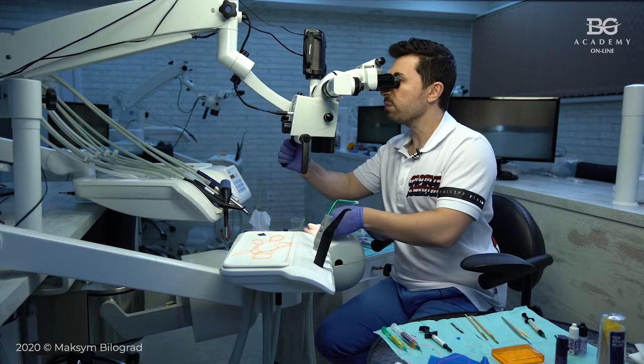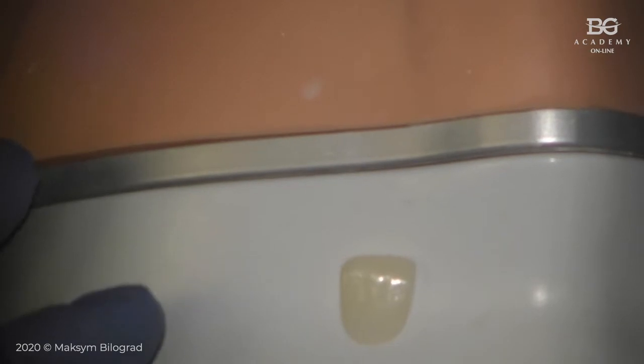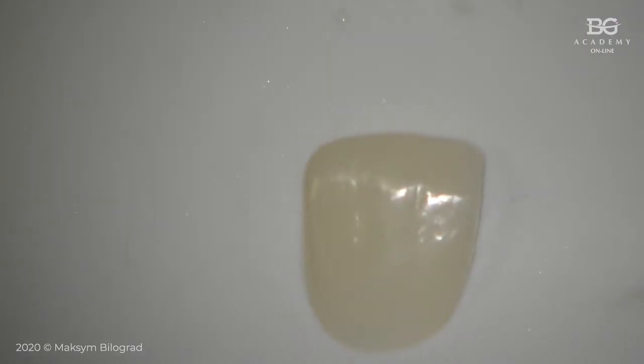Let me just put my veneer here in the eye of my phantom. We're not doing this in the patient's eye definitely, but just here to show you through the microscope the process. Yes, like this. Okay, so we will prepare this veneer to be easily manipulated during the process of cementation. You can use a special holder from, for example, Optrastick from Ivoclar, or a similar product from Shofu, or you can just do one thing that I will show you right now.